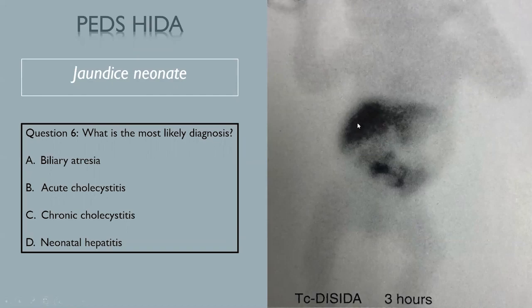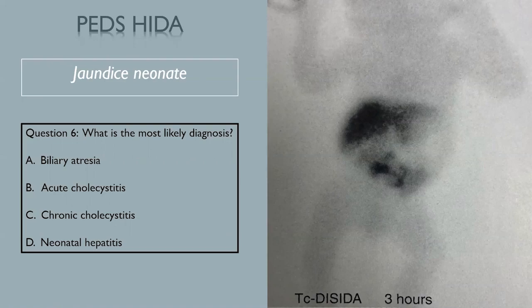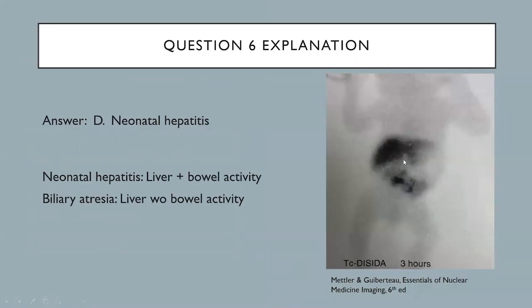Moving on to pediatric hepatobiliary studies, these are usually done in jaundiced neonates to differentiate between biliary atresia versus neonatal hepatitis. In this case, radiotracer activity is seen in the liver with progression into the small bowel — this is neonatal hepatitis. When you see liver activity and bowel activity, that means activity progressed from the liver into the biliary ducts and into the small bowel, so that cannot be biliary atresia. Liver activity plus bowel activity equals neonatal hepatitis; biliary atresia shows liver activity without bowel activity.